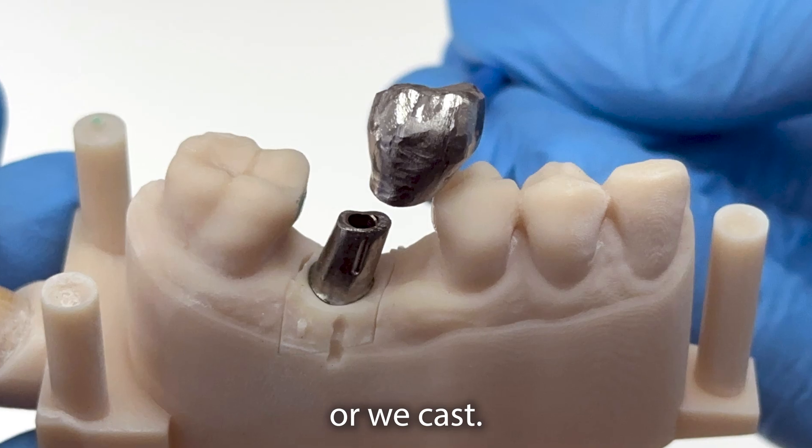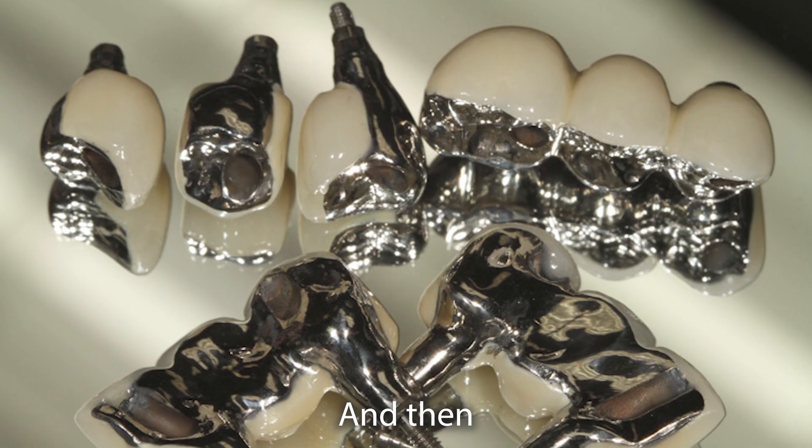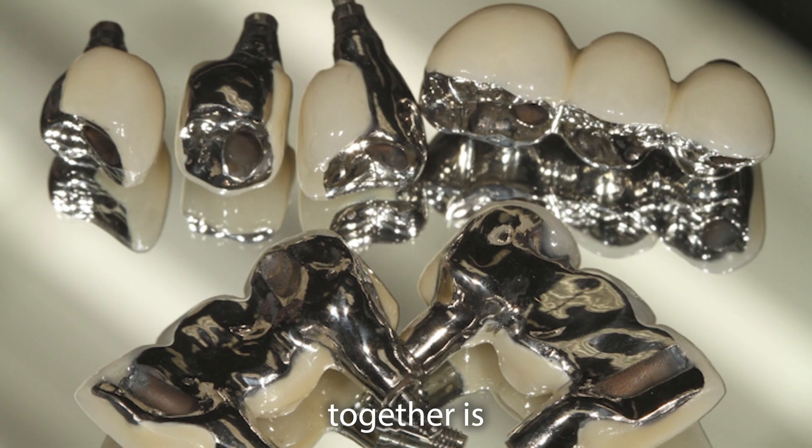What is the best option then? Maybe you could do the UCLA technique, or we cast. The UCLA technique uses wax and cast metal. Full metal is better. Fused together is better.